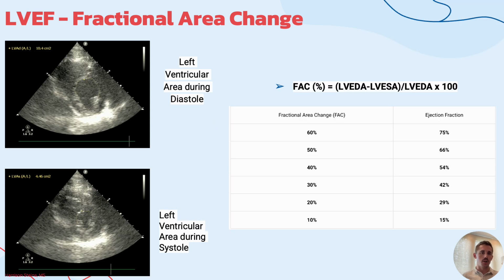So I think this one's a bit harder, just because as opposed to having a defined image of where that interventricular septum and the ventricular wall are stopping, you are needing to look at a parasternal short axis view and not fully aware of how high or how low you should be going in terms of diameter. That's at least my take. Obviously, someone who's much more experienced with ultrasound could probably find it in both.